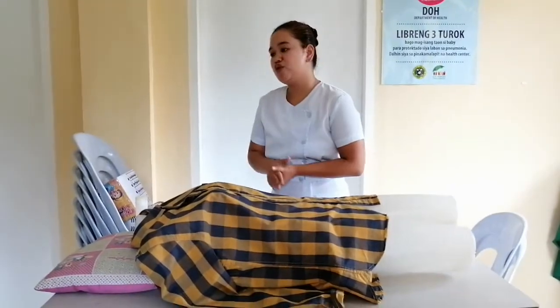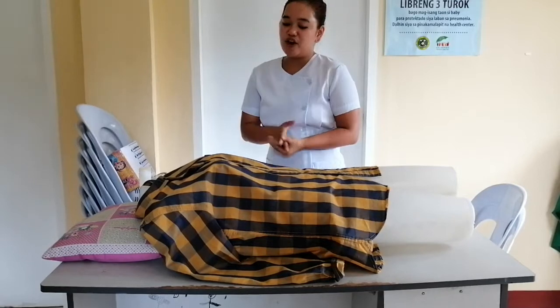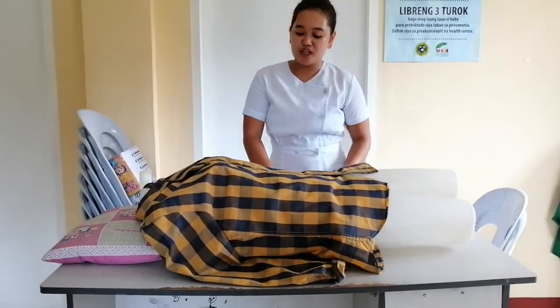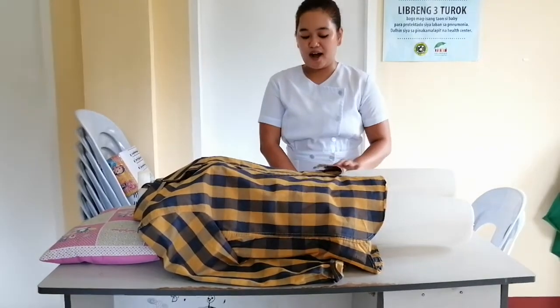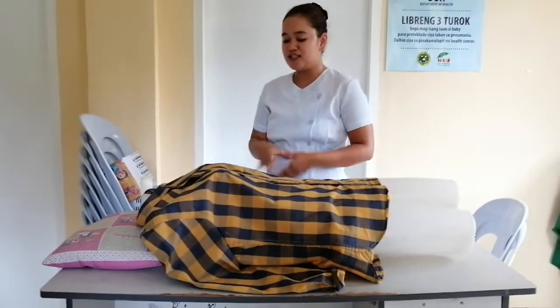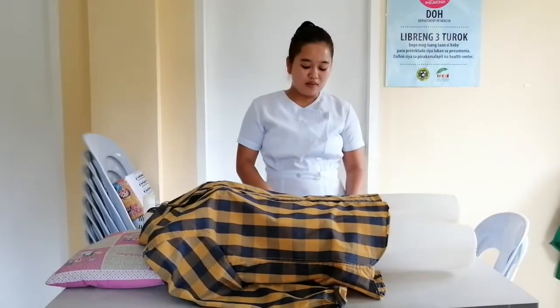You're going now to introduce the procedure to the client. So ma'am, today you are going to undergo the ECG procedure wherein the electroconductivity of your heart will be tested, and also the function of your heart via visual presentation. It will be assessed and it will be examined.